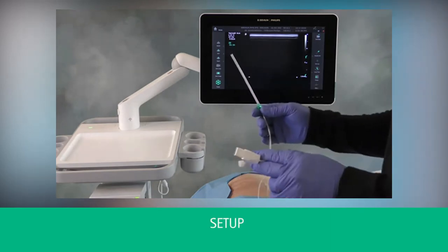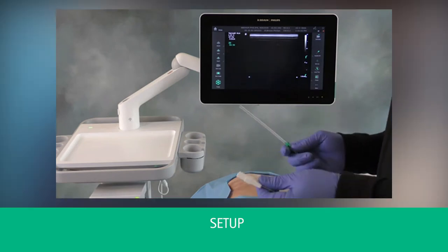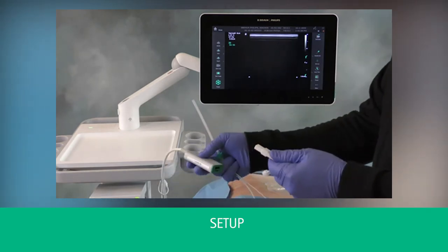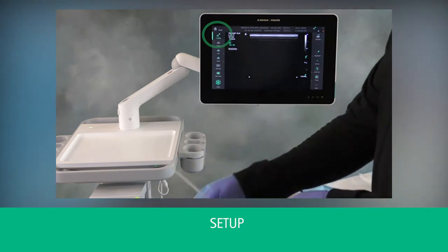We have the StimuPlex OnVision Needle. It comes with lure connection and extension, as well as a connector. This connector is plugged directly into the OnVision system cable.